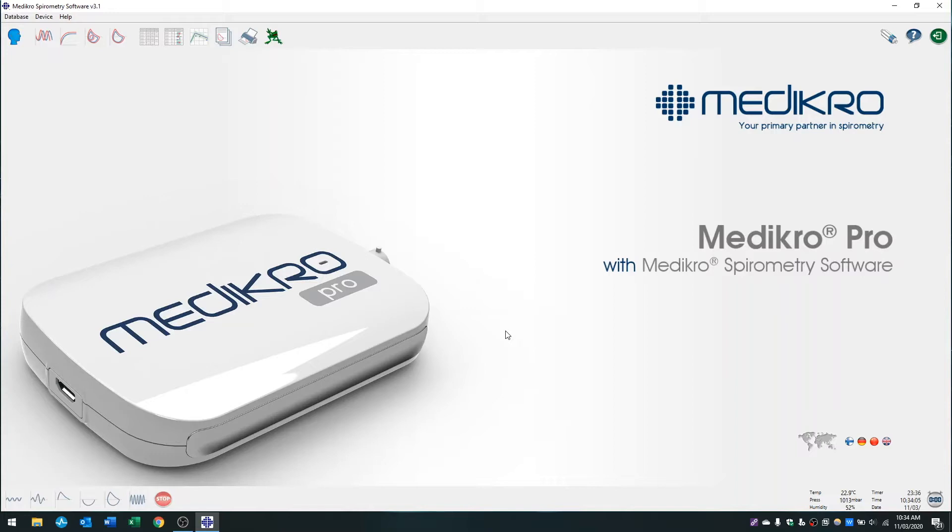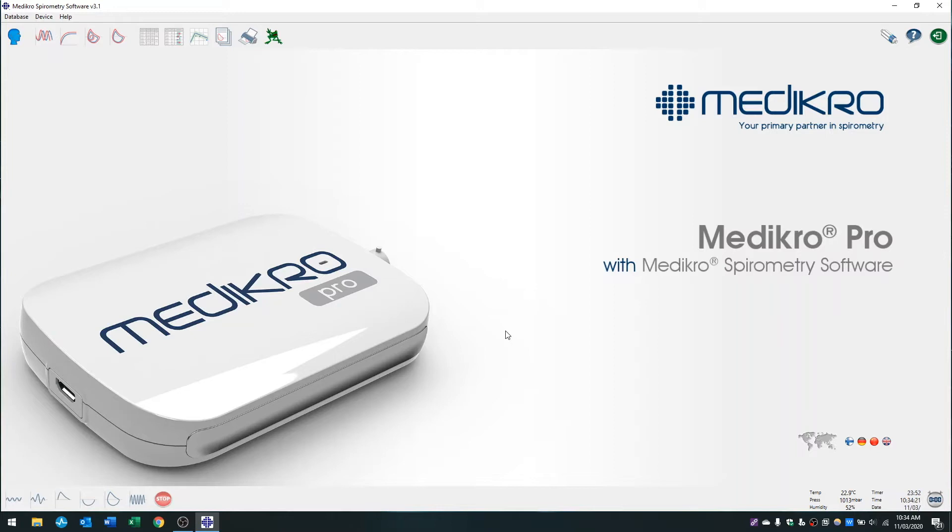As you can see, my software is already open. I've already got my spirometer with everything put together and the mouthpiece inserted nice and tight into the calibration syringe. This is very important to ensure there's no leak.